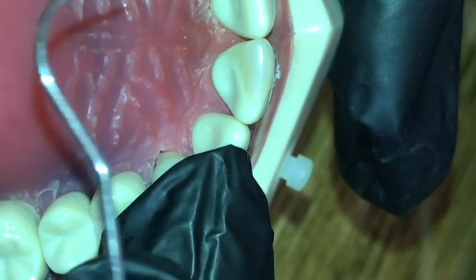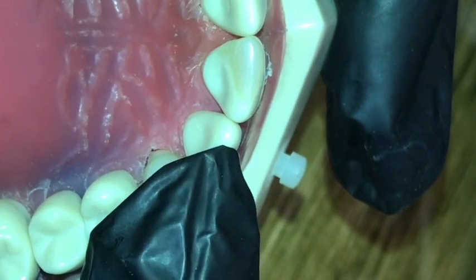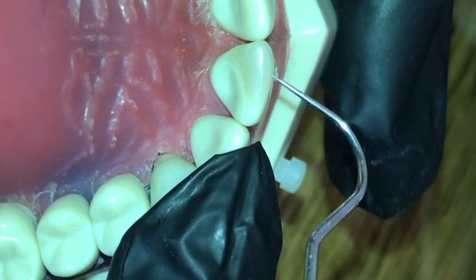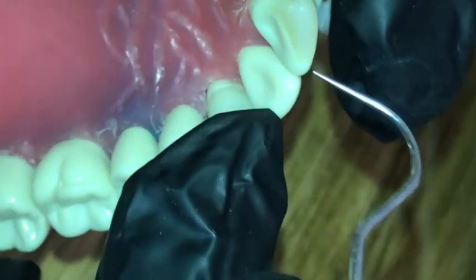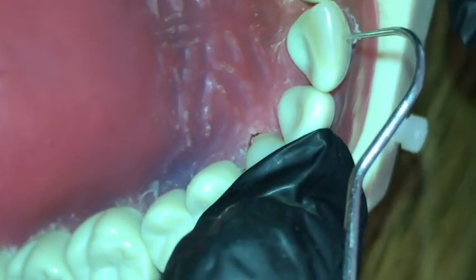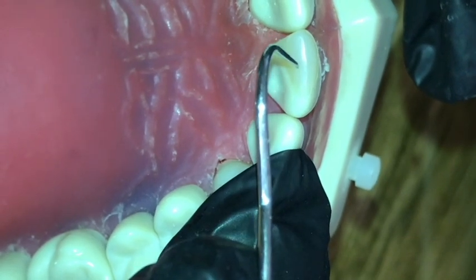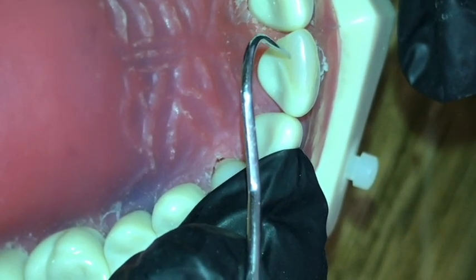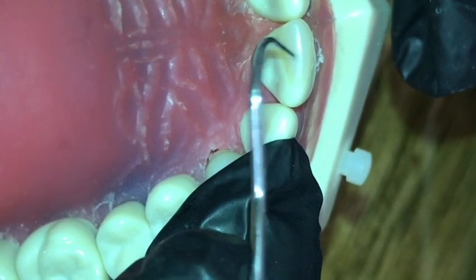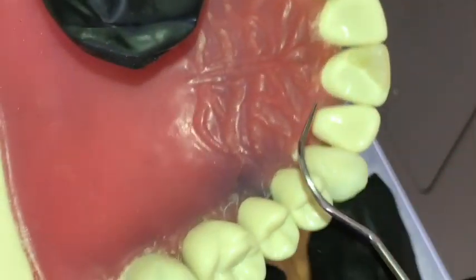And also you can assess the contour from a palatal side as well, so there should be no obliterated embrasure or bulky marginal ridge. Also your incisal edge should be rounded, so there shouldn't be any sharp angles or sharp line angles between the labial, palatal, and incisal edge. So you should make sure you round that with the Softlex disc. The position of the restoration can be exactly determined from the incisal view.